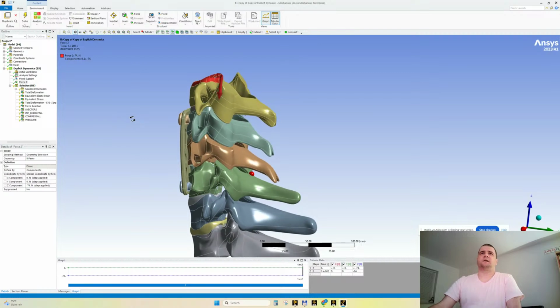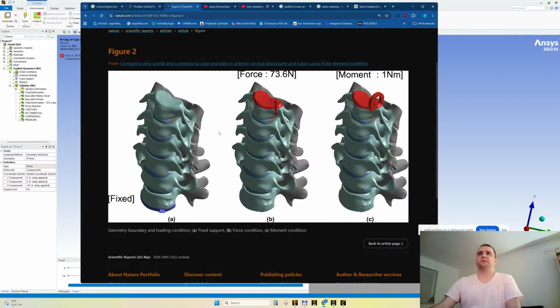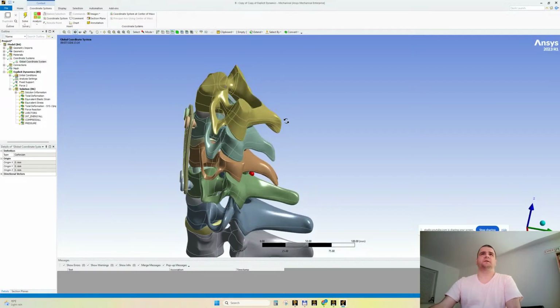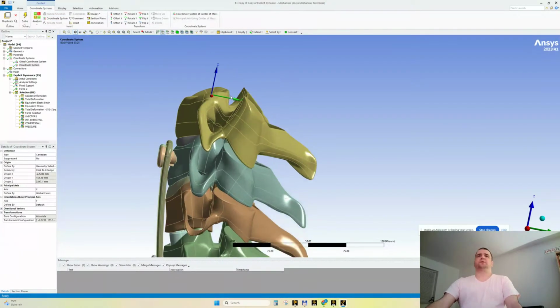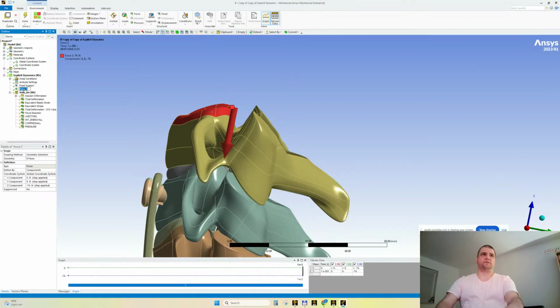I said something like, this is already slanted, I don't want it slanted, because I think it's not slanted in the paper. No, it's not slanted. Let's make it perfectly vertical. To make it perfectly vertical, the easiest way is to create a coordinate system in exactly this point, and I will rotate about the x axis. Rotate x, how much? 5. 10. Yeah, it's perfectly vertical. So now this force, which is force 1, will be applied according to our coordinate system.